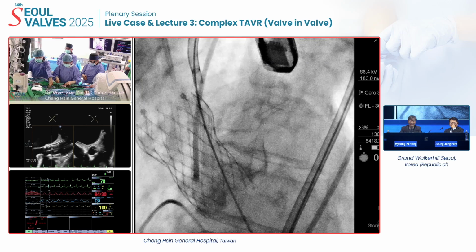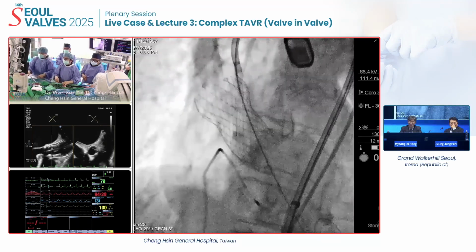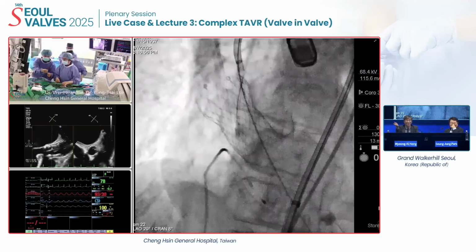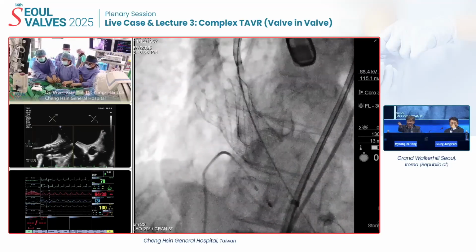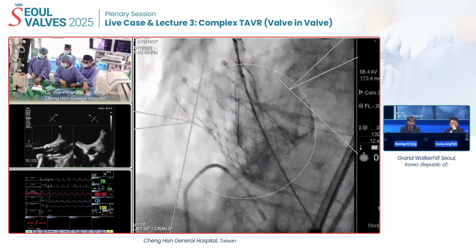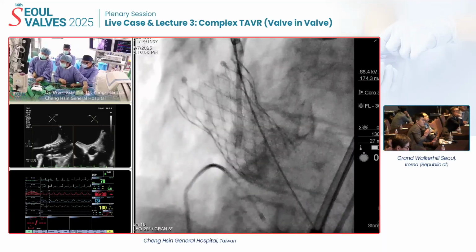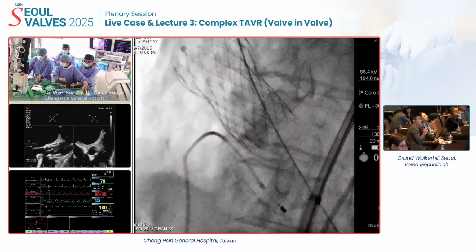They're going to engage the right coronary. Protect the right coronary. Because there is no communication, please explain the procedure for the audience right now. I think they're also protecting the right side now as well. So they're trying to engage and protect the right side before further deployment and before further balloon dilatation of the fenestration. They're going to make sure the right side is protected first.